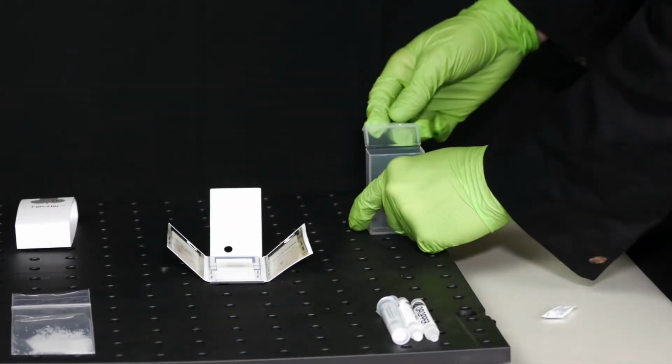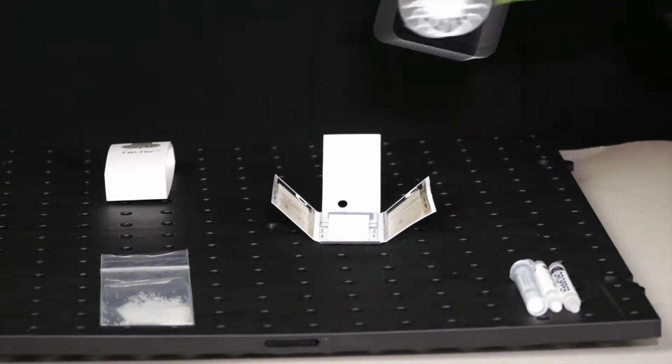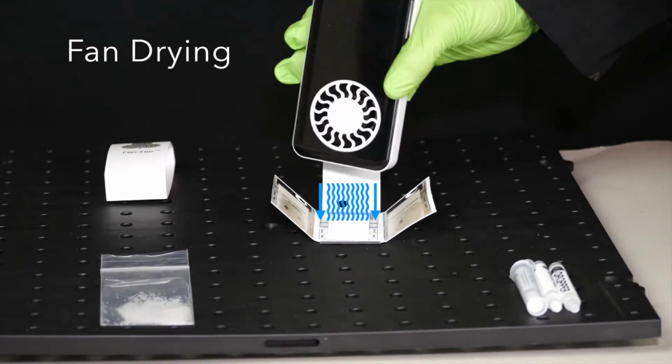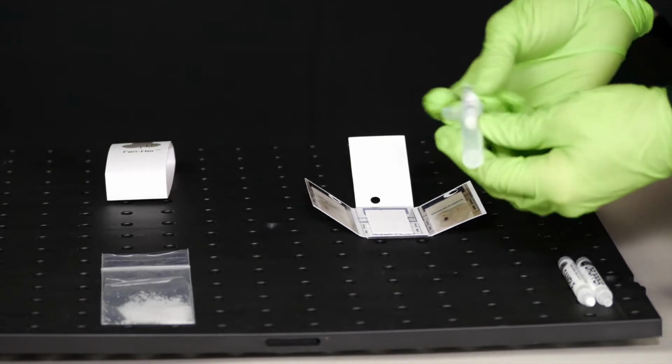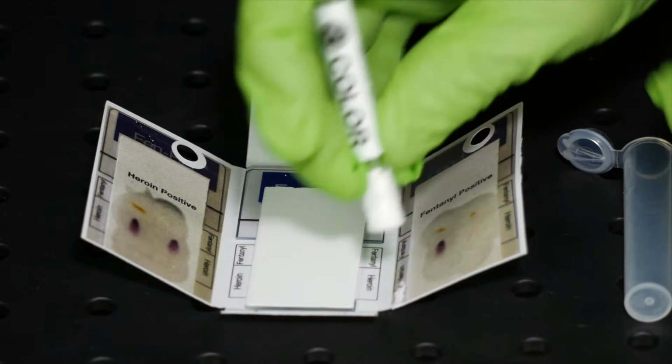Move chamber away from the drying plate to avoid contamination. Air dry plate for at least 7 minutes. Use a fan or a blow dryer to shorten the drying time. Remove the color tube from its container. Break and squeeze the color pen to wet the swab.